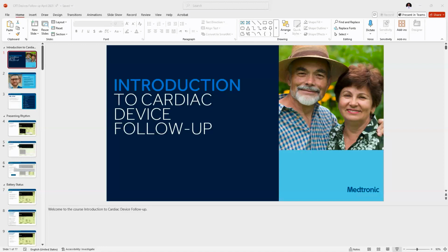And here you're able to see this is the mode, this is the AV delay, and this is the lower rate. So in case a patient has a complete heart block, it might be difficult for you to unmask the ventricular activity at this AV delay. So you can change the mode to VVI, and if you change the mode to VVI, you're going to eliminate the AV delay. Then you can lower your rate to 30, maybe if the patient has a rate of 34. And at that rate, you're able to unmask the intrinsics, both the P wave and the R wave.